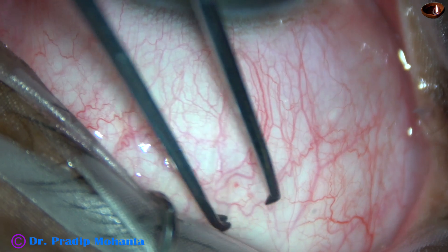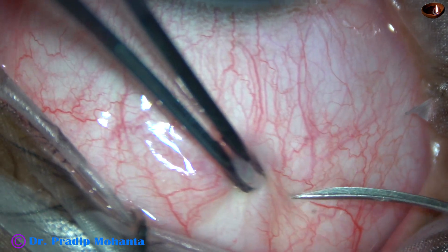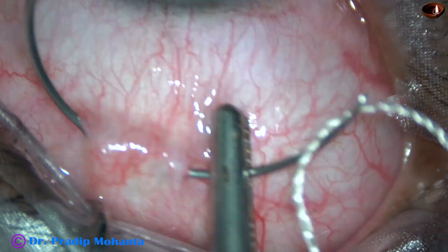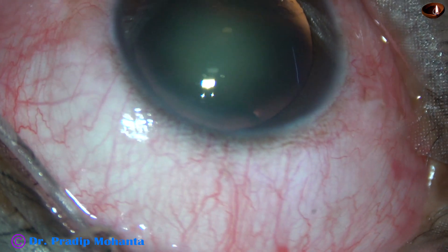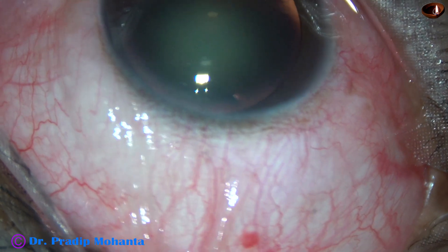Superior rectus bridal suture is applied. The eyeball is turned down with the help of a muscle hook. The superior rectus tendon is held and a thick nylon suture is passed underneath the superior rectus tendon. This bridal suture will act as a third hand.